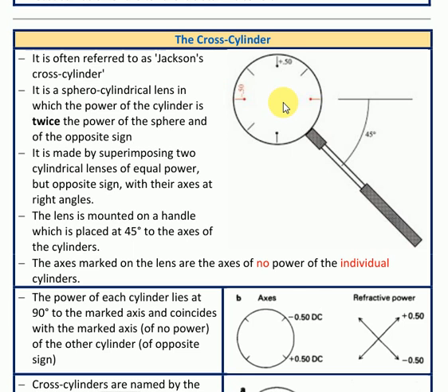If the patient prefers one of these options to the sphere alone, then a cylindrical correction is necessary. The exact axis and power can then be determined by the methods described above. To achieve the best result from the test, it is important that the patient has the clearest vision possible before the cross cylinder is used.